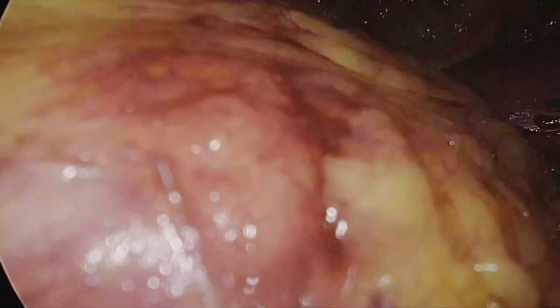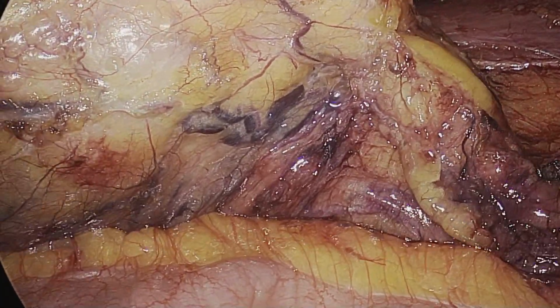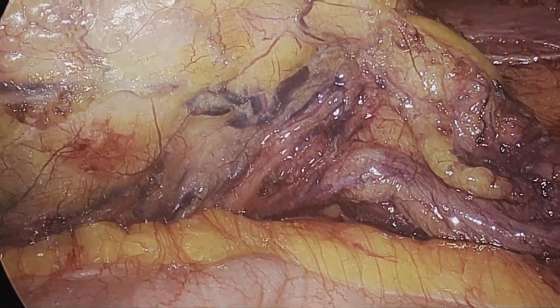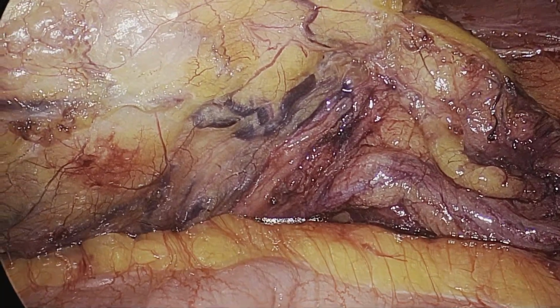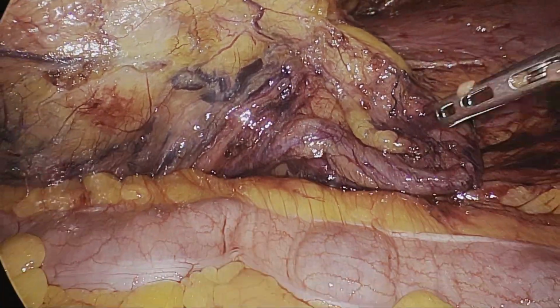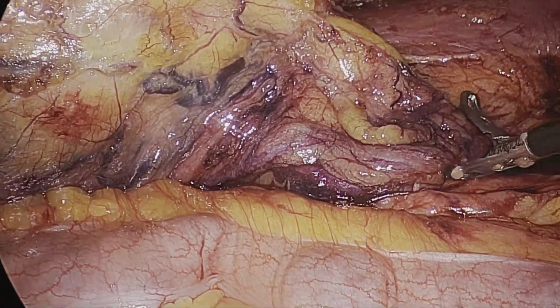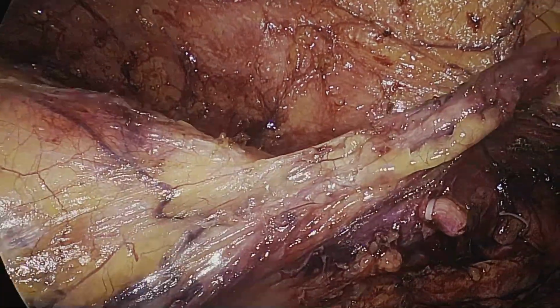So here, the complete radical nephrectomy has been performed. Intact Gerota's fascia, the ureter enclosed in it, the gonadal vein within, and nowhere have the oncological barriers been breached. Now we are holding the specimen at the ureteric end, and now we'll start the extraction of the specimen.